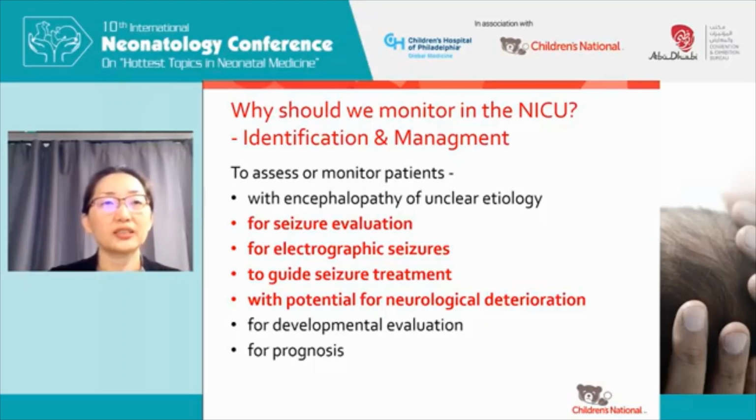gross trends. It's not going to give me the resolution of the electrical activity in a millisecond and second pattern as an EEG. So I will not be able to tell you, oh, this type of encephalopathy on the AEEG looks more like hepatic versus encephalitis versus HIE the way I can on an EEG tracing, but it can tell you who's encephalopathic and how severe and whether that encephalopathy is getting better or worse.